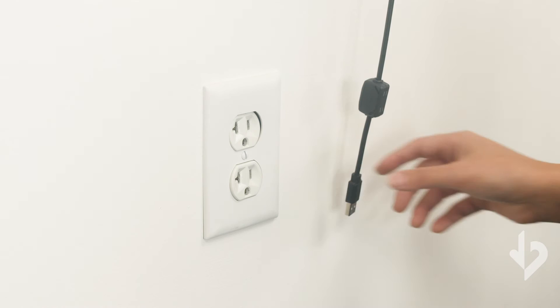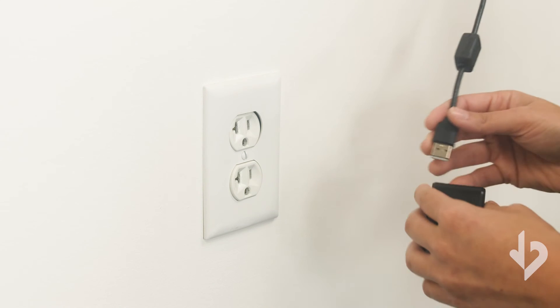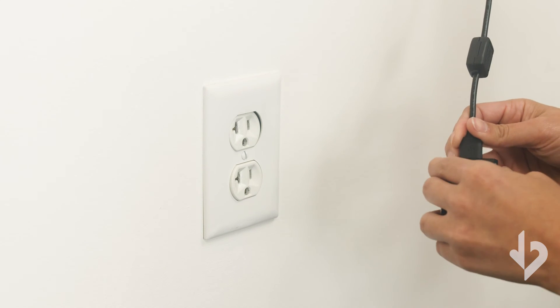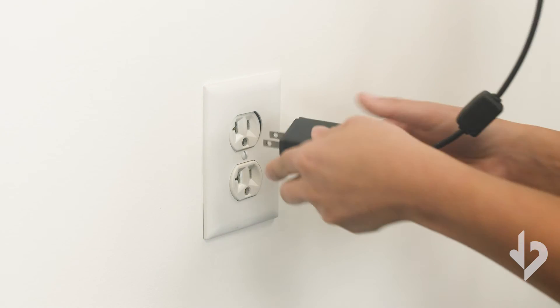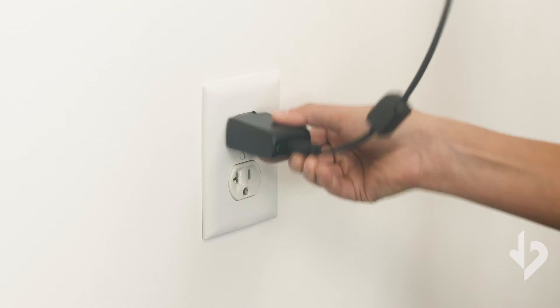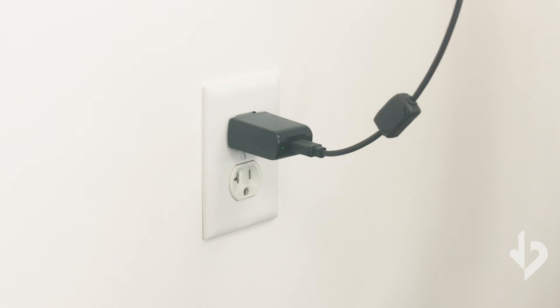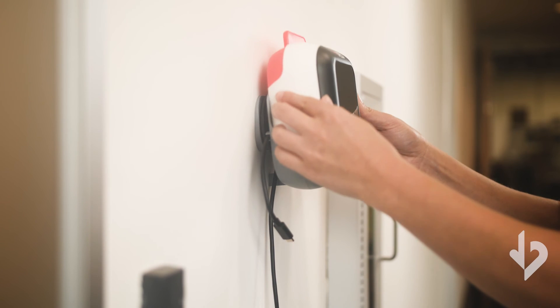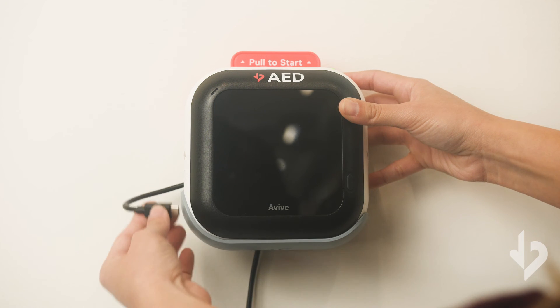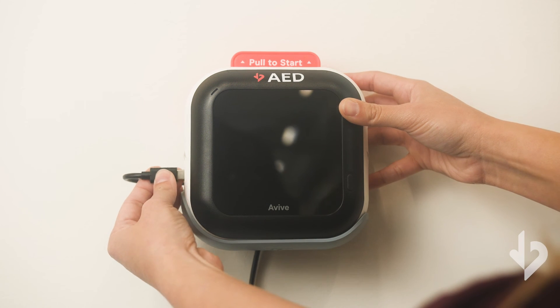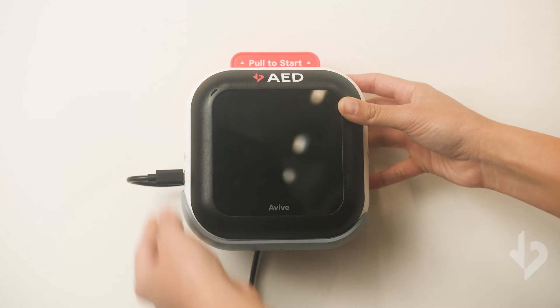Plug the USB cable into the USB power adapter and plug the adapter into an outlet. The Vive AED can now be placed in your Vive charge stand and charged using the USB-C plug.